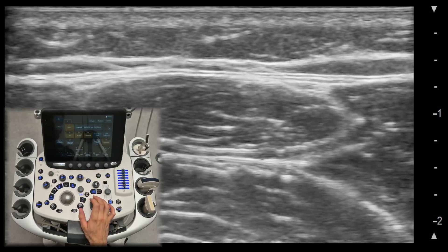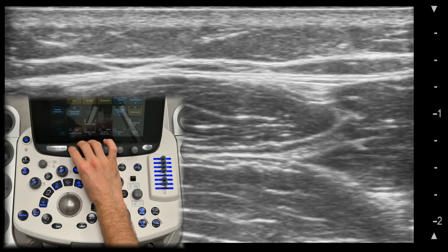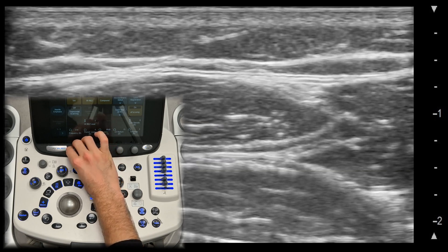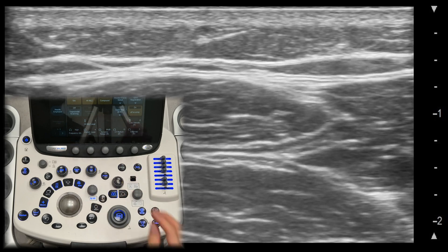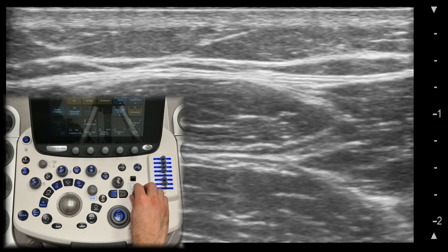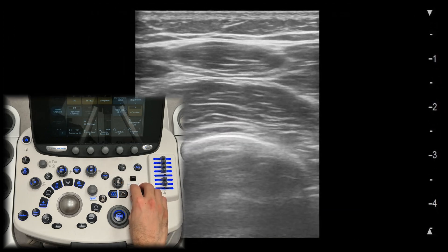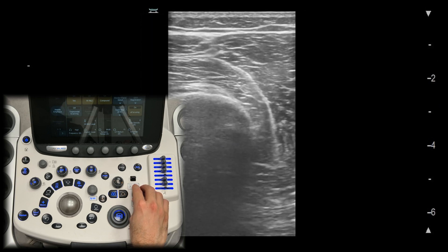The frequency settings allow you to adjust the sound waves the probe sends into the body. For MSK ultrasound, higher frequencies provide better resolution but less depth, while lower frequencies offer greater penetration but less detail. Adjust the frequency depending on whether you are scanning deeper or more superficial structures.